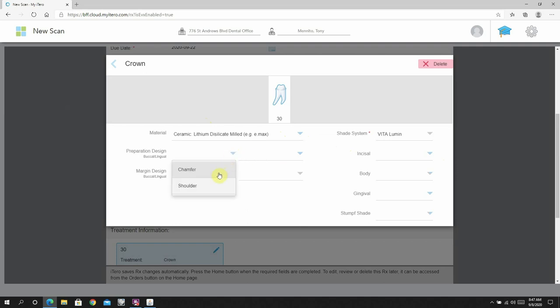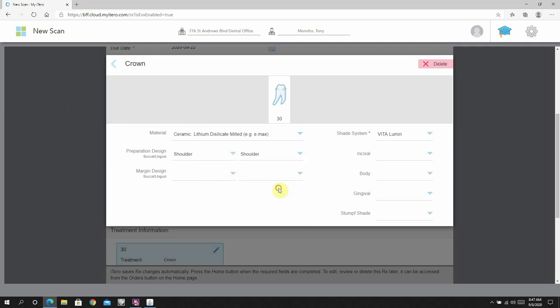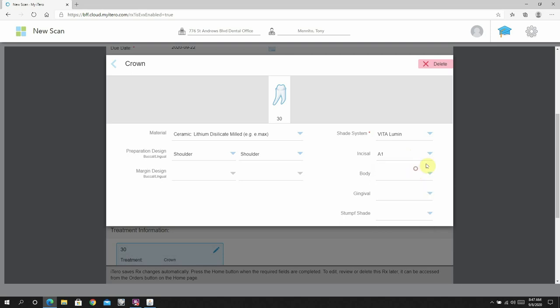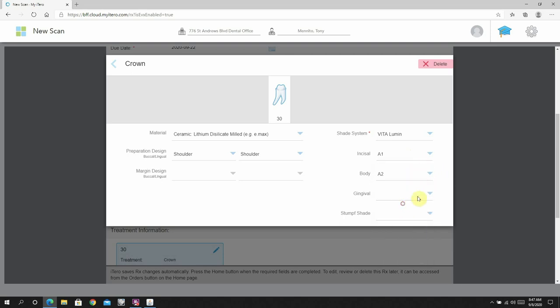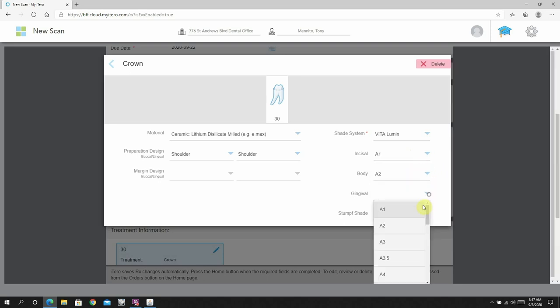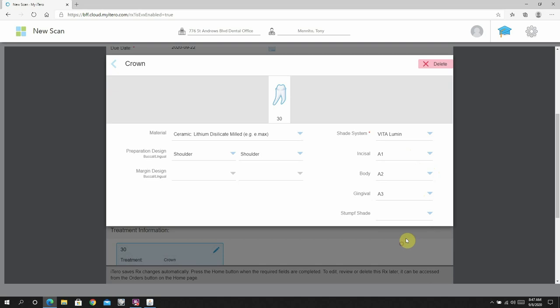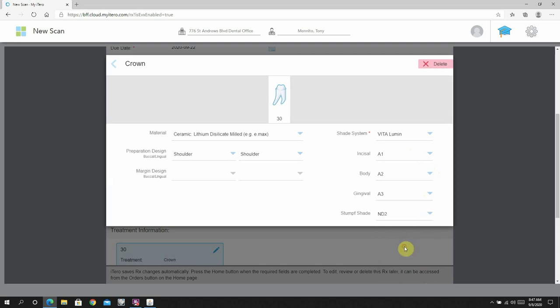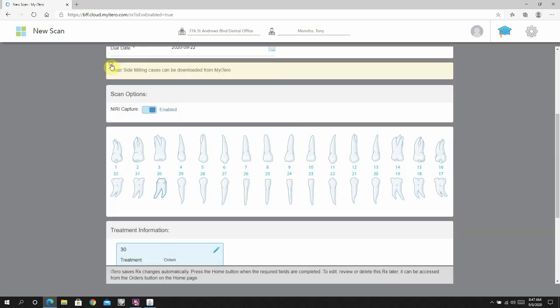You can also do things like select the tooth you're working on if you're doing a crown or veneer or whatever. Pick which material, pick the shade, even preparation design, things like this. This is totally optional, but I find that having some redundancy in this information is not a bad thing, just in case that information is not able to be found in your clinical record.